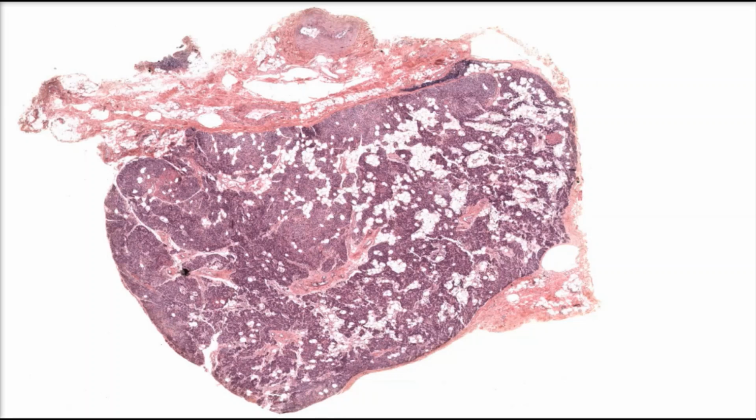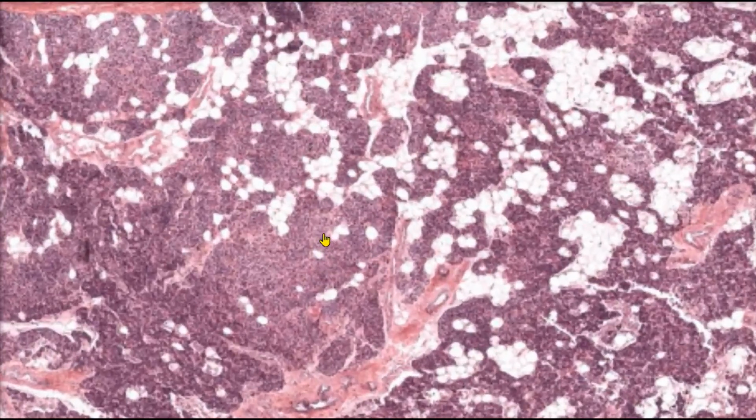This slide shows the parathyroid gland. The prefix para means next to. This gland is next to the thyroid gland. An easy way to tell the thyroid and parathyroid glands apart is that the parathyroid gland does not have follicles packed with colloid. Instead, it has a very dense mass of cells. Let's zoom in so that we can see what I'm talking about.